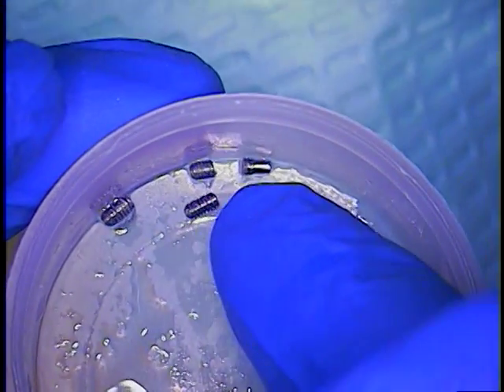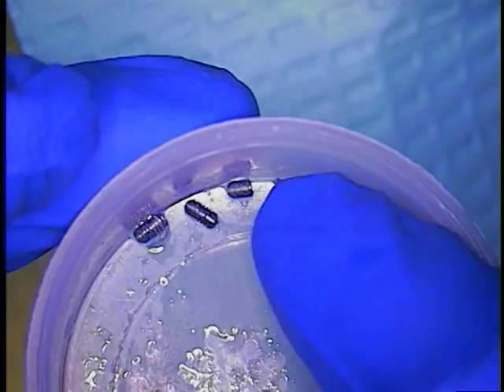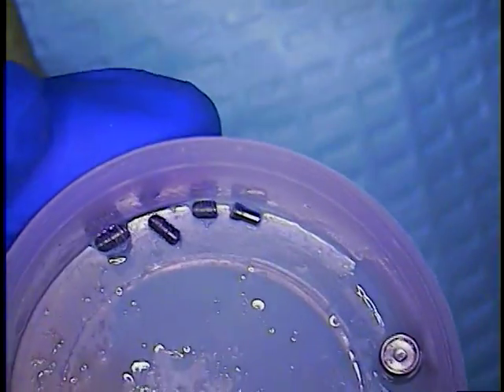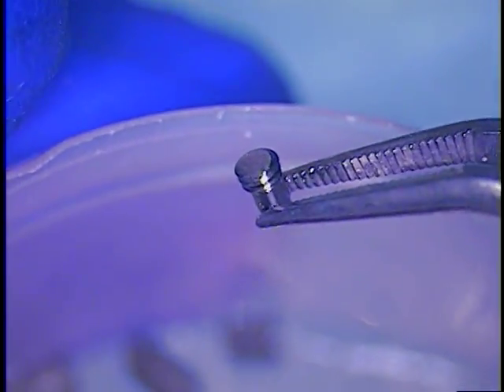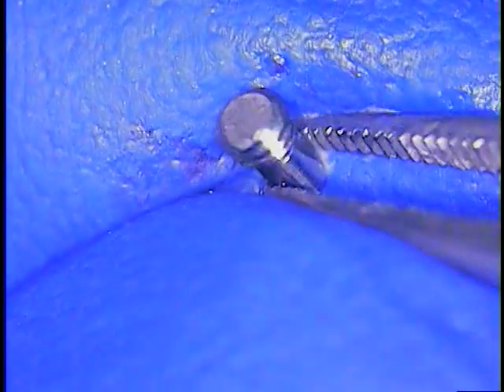I thought I had an easy one — a fracture that would come out with the stem, how easy that would be. But I found out that it had separated. And you can look at the topography, which I will show you right now. This is what you are going to learn when you do take these out. Look at the actual topography — that told me right away that this wasn't just the screw. That was easy to remove, and so easy it was. But look at the topography. You see the little lip right there? That immediately told me it was not like a regular screw fracture, and to continue to look and find the problem.